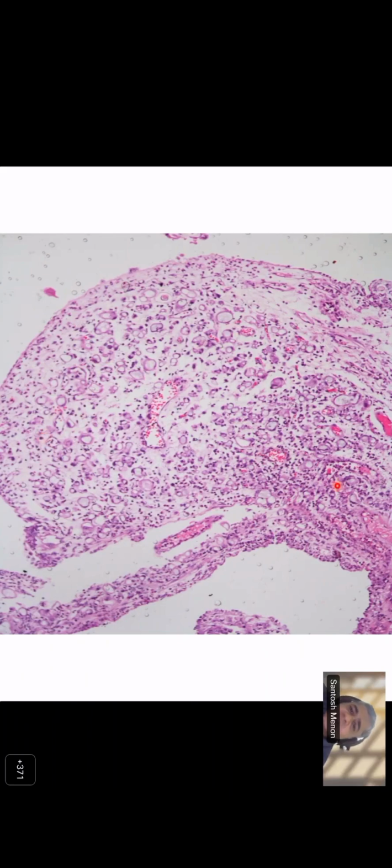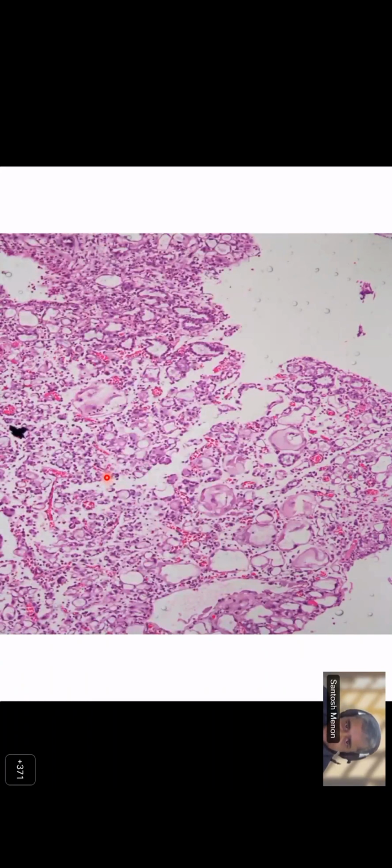And there are a lot of inflammatory cells. Yes, some scattering of inflammatory cells. So this is a field where you don't see the tubules, you don't see the glands. This is completely looking like varying size capillaries, query signet ring cells with some mucinous material. Again, higher power shows some more areas. So you have some congested vessels. You have these blank looking capillary-like areas, and then you have these tubules. Everybody agrees that these are tubules or glands or acini? Yes, sir.